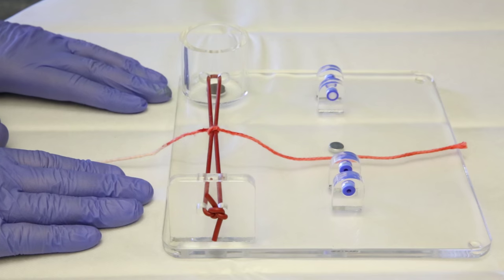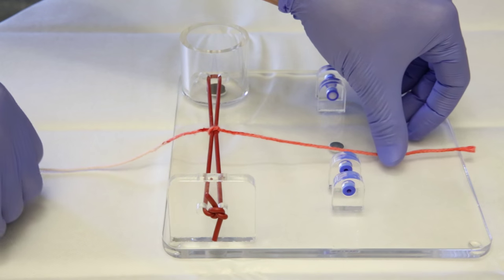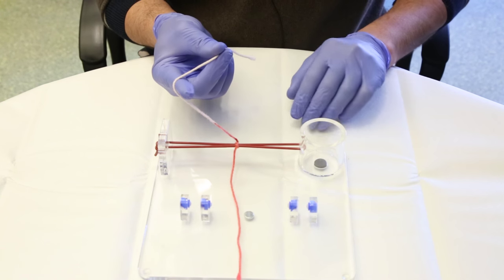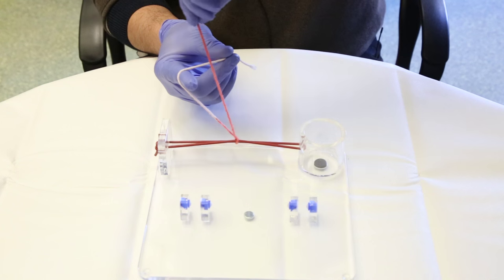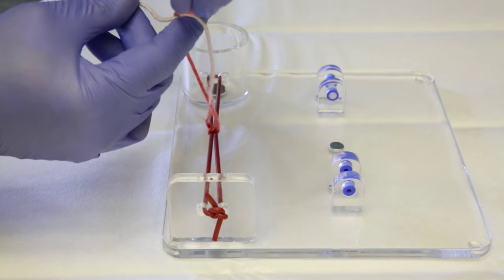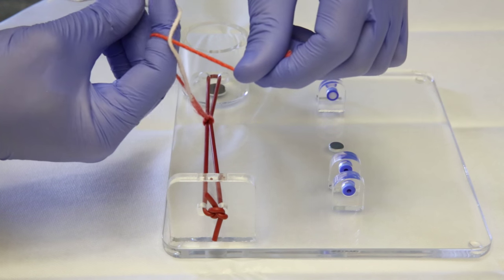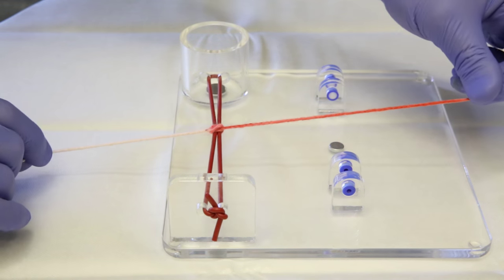To secure this knot we have to do an opposite knot. Again we hold the tie with the right hand, but this time with the middle finger and thumb. We cross the rest of the tie around the index finger while the assistant hand comes from the opposite side to form the loop. Then we cross the finger on top of the left hand tie and below the right hand tie, take the tie inside the loop, and tighten the knot.